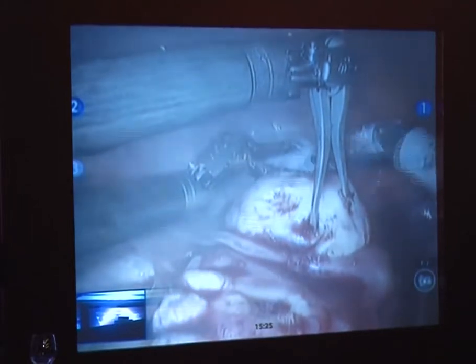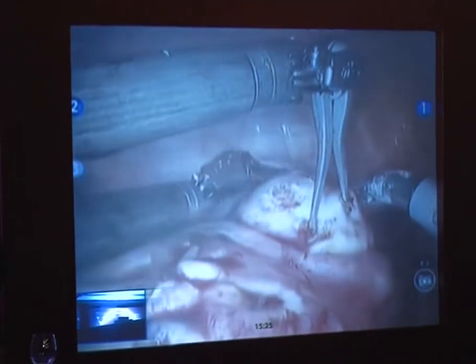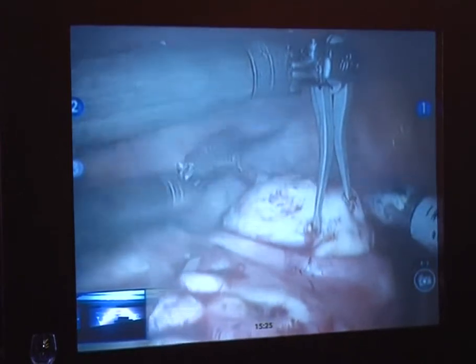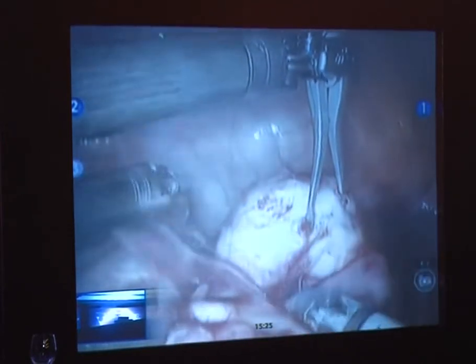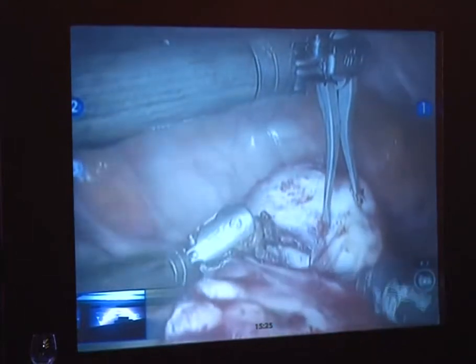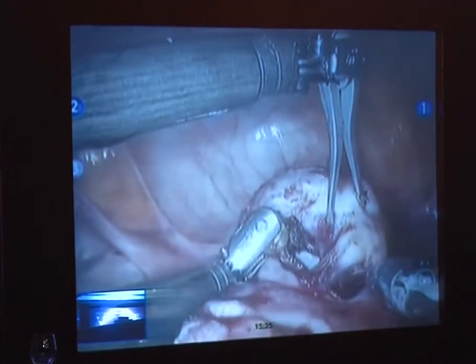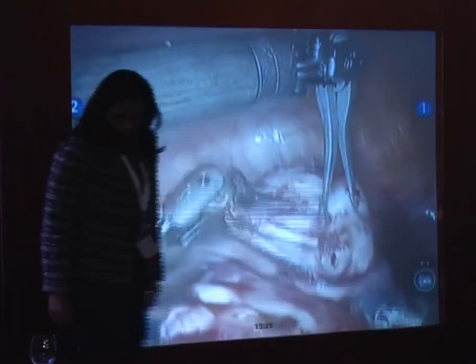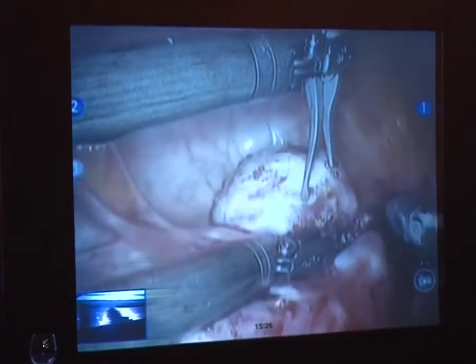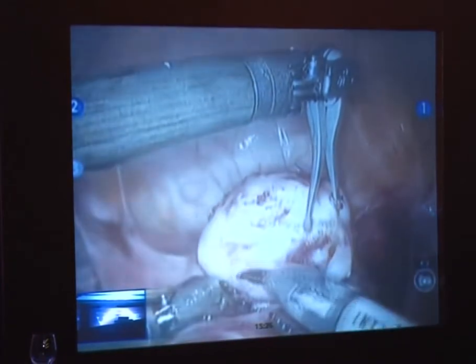Arnie, I noticed she had a small subserosal fibroid posteriorly. I'm sure you noticed that. Do you bother with those? I don't. If there's not really any major issue with that, I leave them alone. Again, I just think the enemy of good is better. If it's not a problem, I leave it alone. It's pretty small. No need to put an incision there unnecessarily and have her uterus stick to the bowel. You're not tempted to do a myolysis type of process on it? If it looks like it's easy to do, but then again, that also creates adhesions, right?